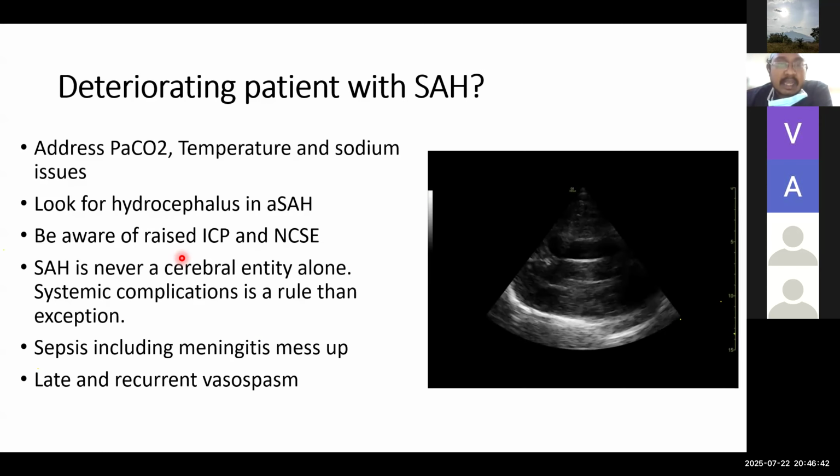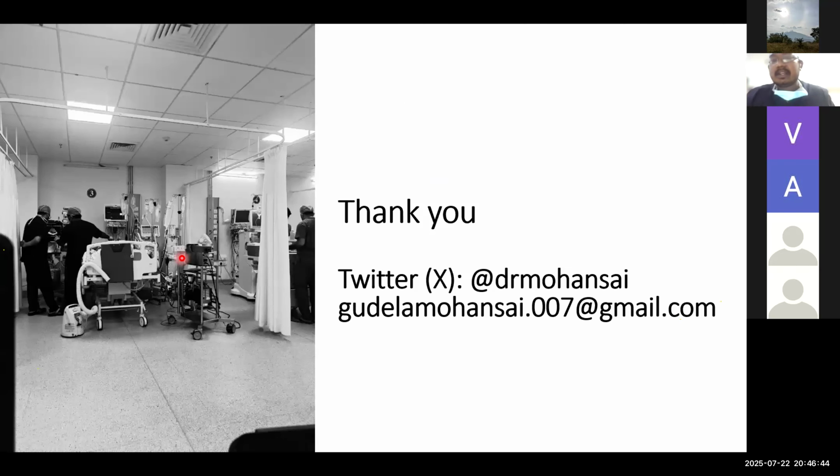So I end my presentation. The key takeaways are: always consider vasospasm as one of the differential diagnoses for any neurological deterioration in an appropriate clinical scenario. Use transcranial Doppler. Don't limit yourself to the velocities alone. Go to ratios as well. It's important for us to look at the ratios.